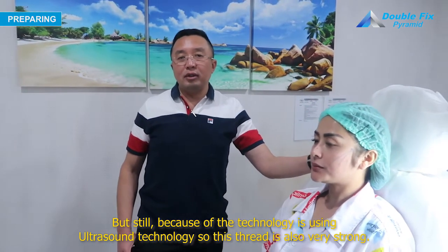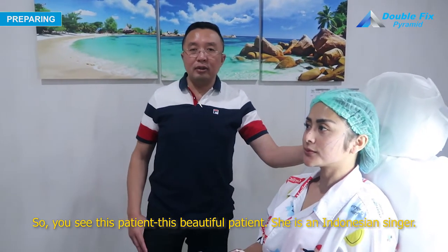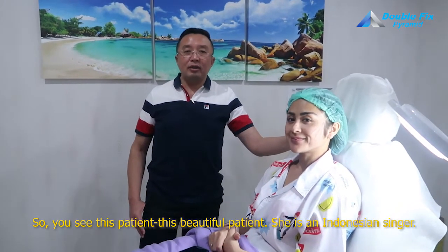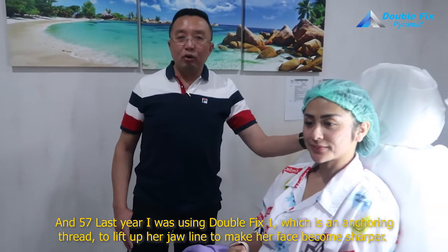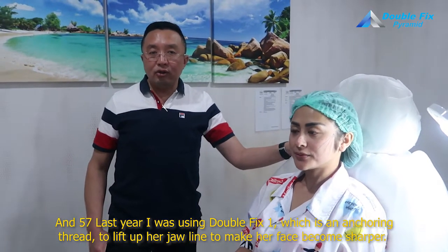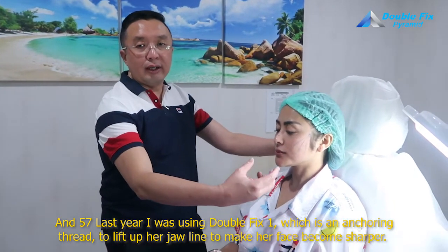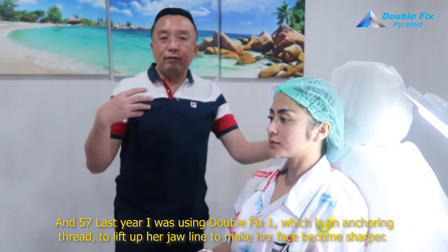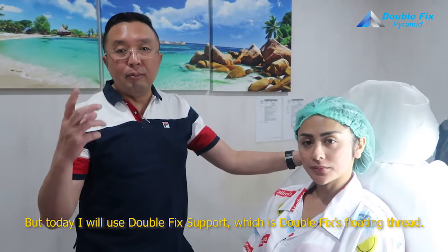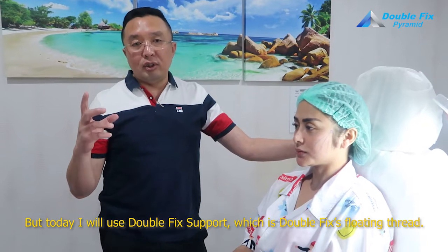So this thread is also very strong. You see this patient — this beautiful patient, she is an Indonesian singer. Last year I was using Double Fix One, which is an anchoring thread, to lift her jawline, to make her face become more sharp. But today I will use Double Fix Support, which is a floating thread.